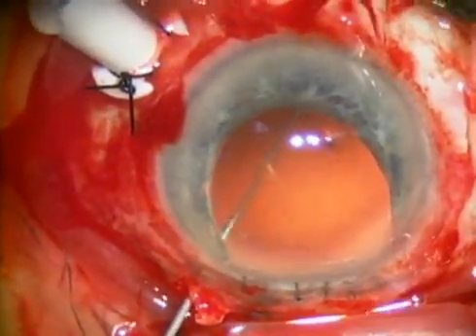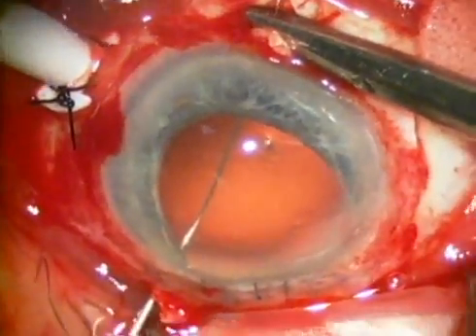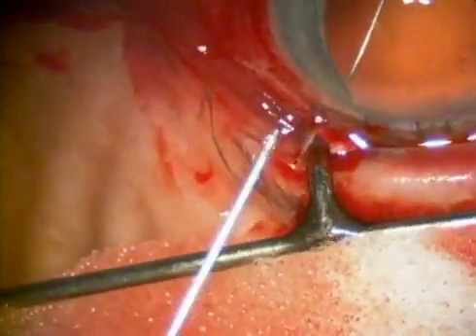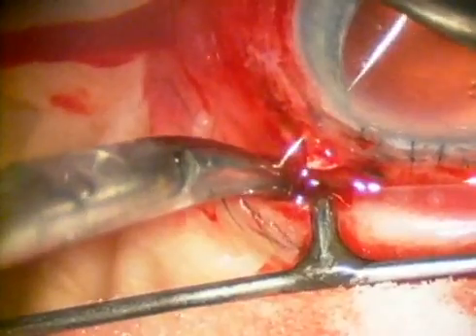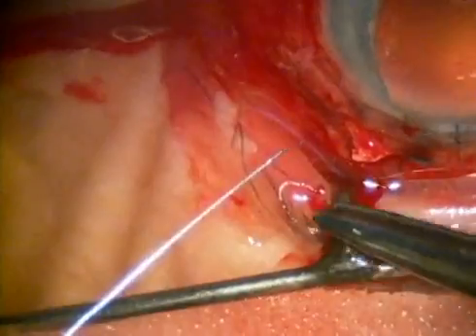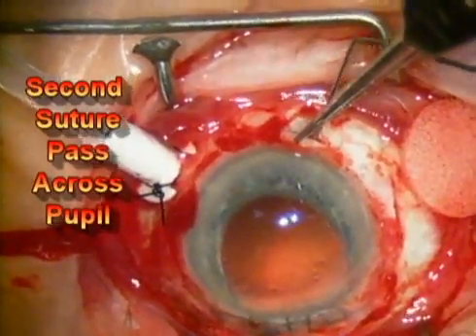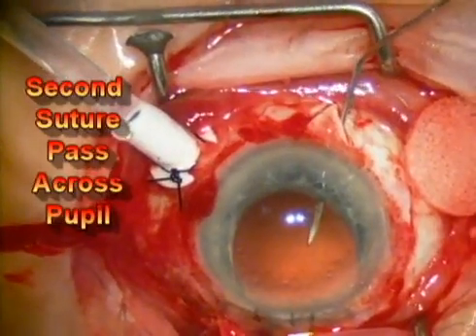The needle is guided across the pupil with the 27-gauge needle, and a fair amount of pressure is placed on the globe so that the tip of the needle comes out the other side of the eye and can be grasped. These needles are all placed underneath the scleral flap. That one was placed toward the left side of the flap, and this next needle pass is done on the opposite side of the scleral flap.